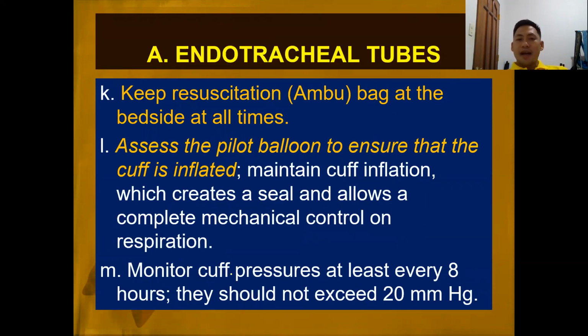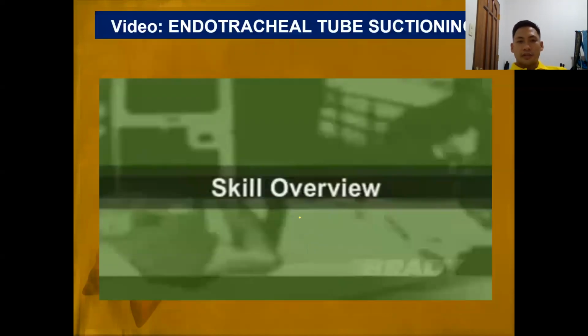Keep the resuscitation bag at the bedside at all times. Assess the pilot balloon to ensure that the cuff is inflated. Maintain cuff inflation, which creates a seal and allows complete mechanical control of the respiration. Monitor cuff pressure at least every 8 hours. It should not exceed 20 millimeters of mercury.